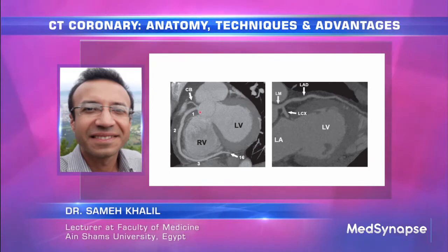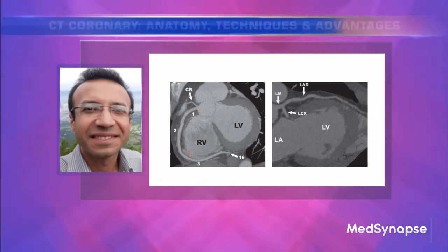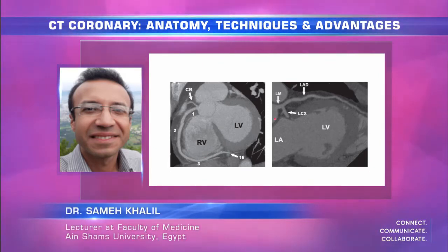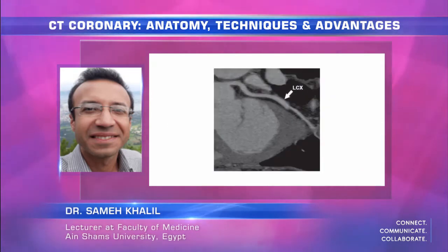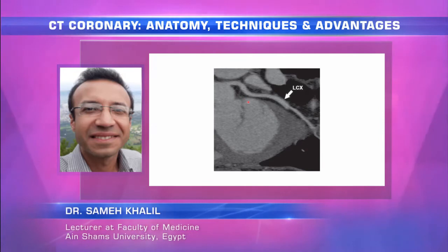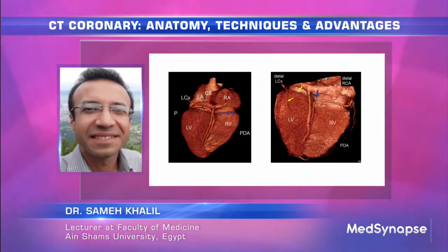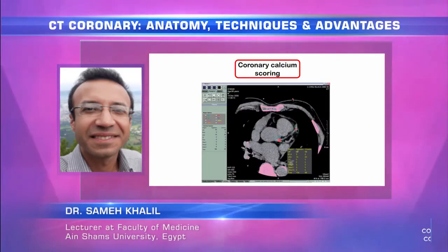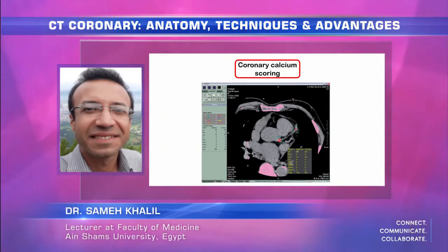This shows CT images of a normal right coronary artery in the form of curved multi-planar reformat, the left main system, the normal view of the left circumflex, and normal views of the coronary arteries, along with 3D reformat images.